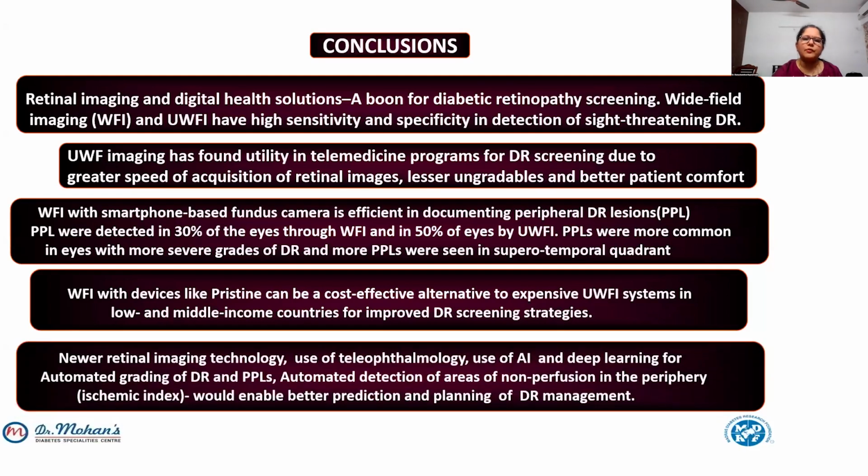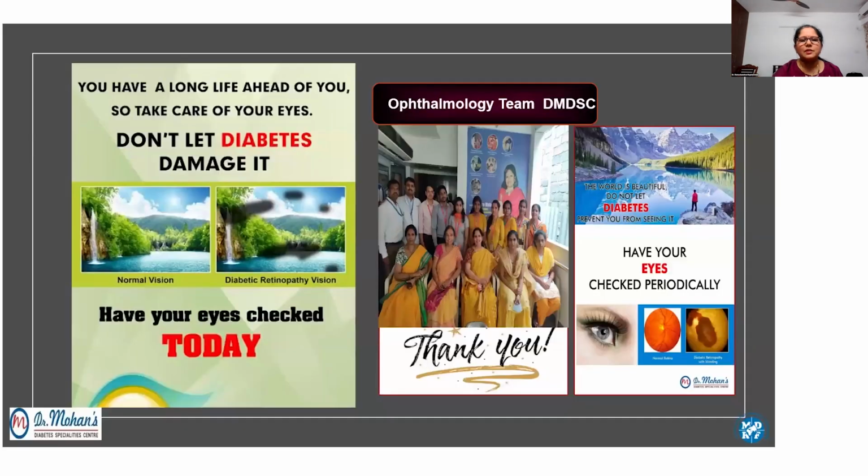Of course, with use of newer retinal imaging technology, using teleophthalmology, deep learning algorithms, automated detection of PPLs, and automated detection of areas of non-perfusion, that is the ischemic index, we would be able to predict and plan DR management better.